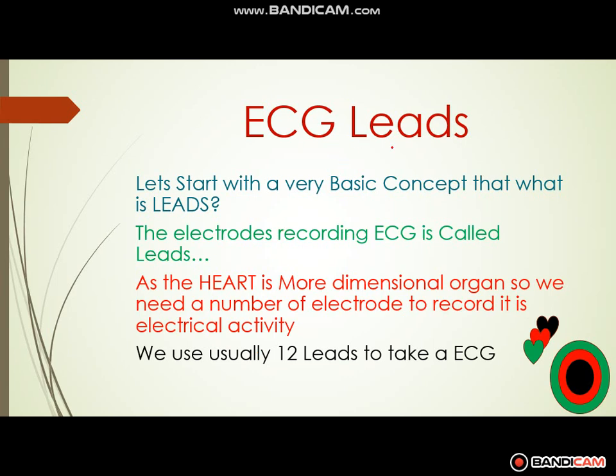So what are leads? I will explain what leads are and how many types there are. The very basic answer is that leads are the tools with which we can record ECG. Leads are electrodes, which record the ECG from the patient. The electrodes which are used to record the ECG, or electrocardiography, of the patient are called leads. They are a special type of electrodes used to record ECG.